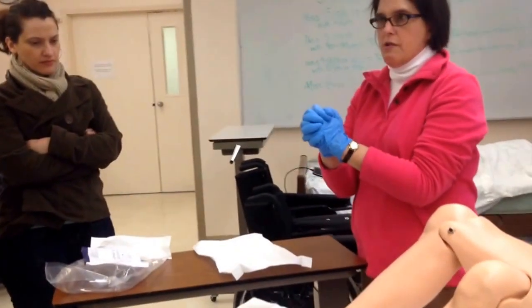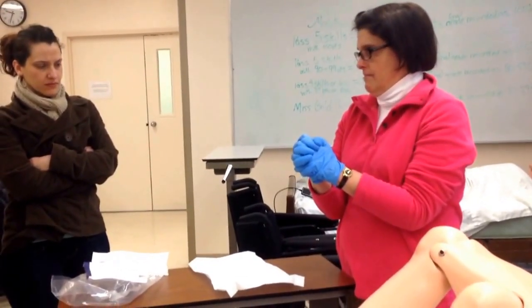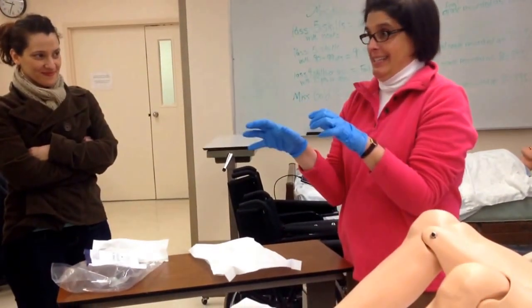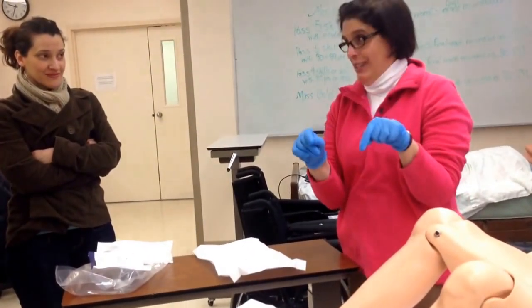Okay, you can do this, but you need to keep your hands above your waist and in your eyesight at all times. Okay? So you're going to go home with these kits, and you're going to actually practice the gloving, because I'm going to watch you all glove. I'm going to watch you all do this independently.